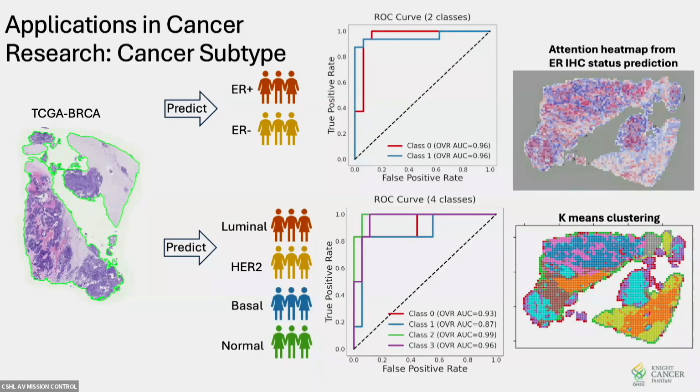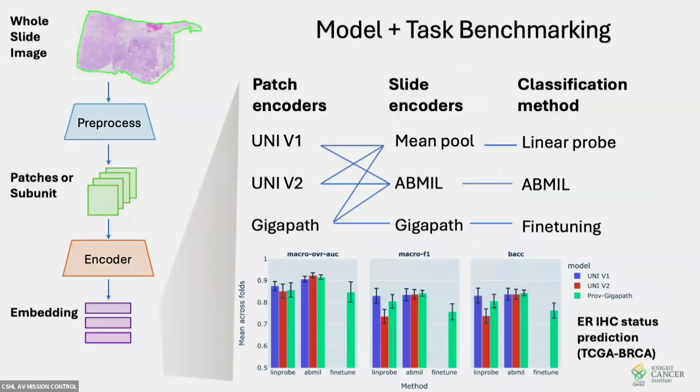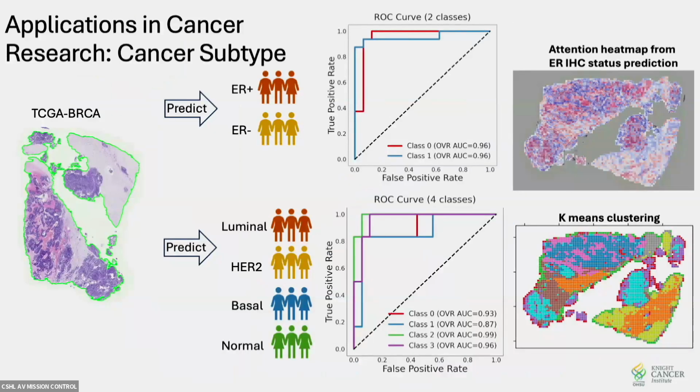So to start with that, we've just been doing estrogen receptor positivity. I don't know if the images are available, but I do know they have if the sample is ER positive or negative. And so we've been able to use, I think this was one of the UNI models and ABMIL that's shown up here. On the top is the ER positive, but we're taking that one step further and then also comparing to gene expression signatures.